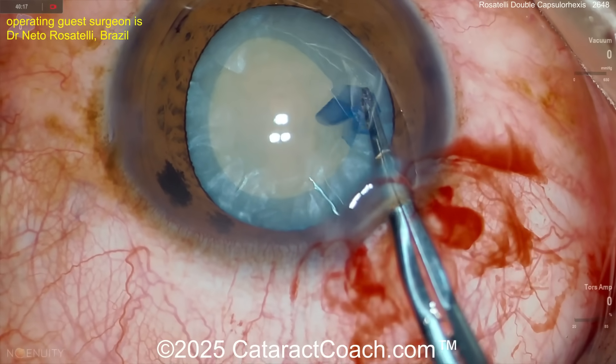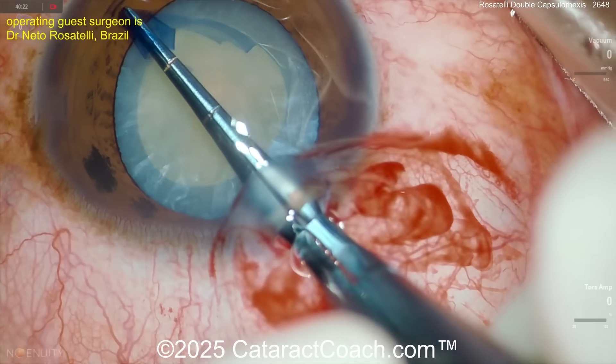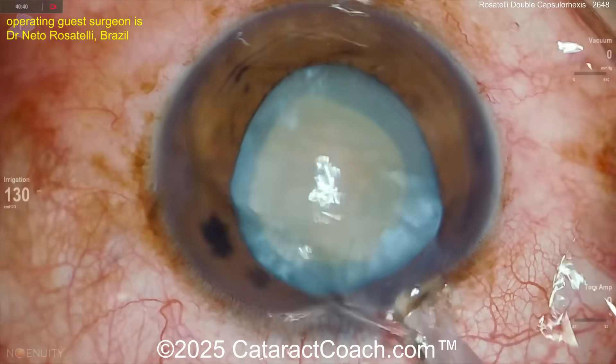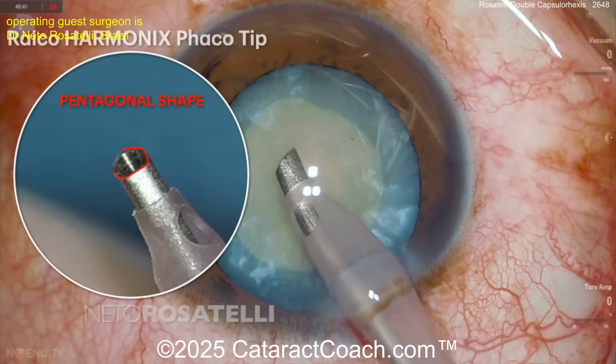Netto is an amazing surgeon with every surgeon's dream — he does surgery five days a week, truly an amazing setup with incredible volume and incredible skills. You've seen the Rosatelli spin — we're not going to do that here.